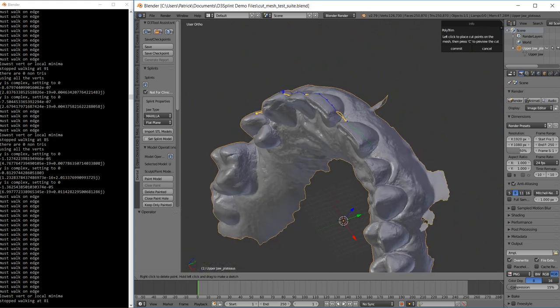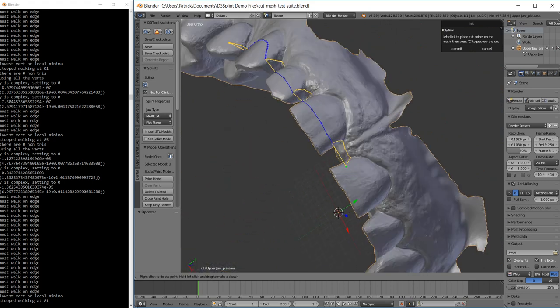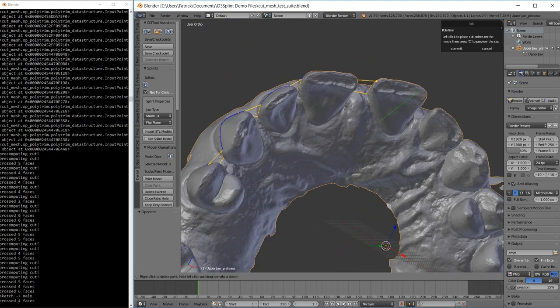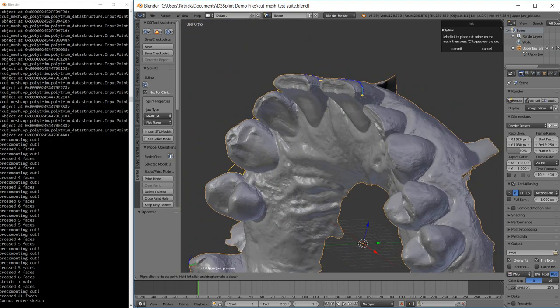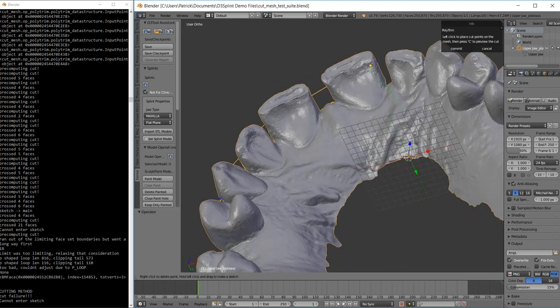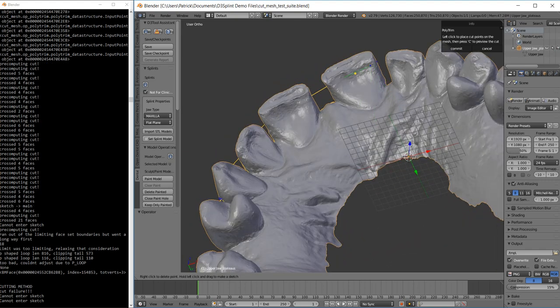The other thing, which I haven't gotten hooked up yet but is well on the way, is that a lot of times you'll end up coming back around. Pretend I went all the way back here, but if you didn't want your splint on the palate, you'd end up coming around like this.